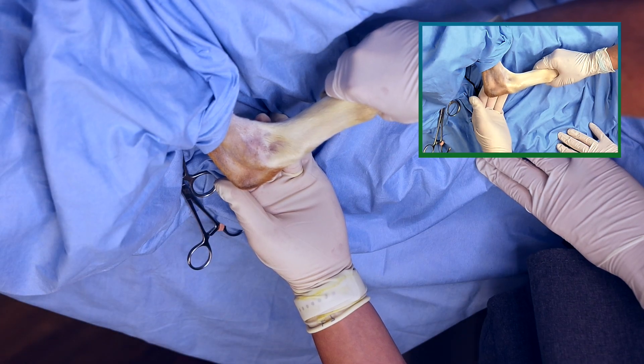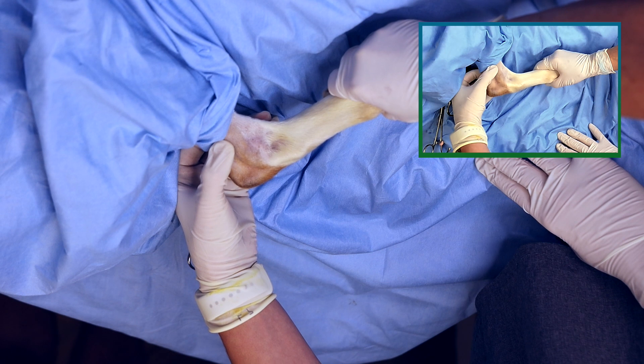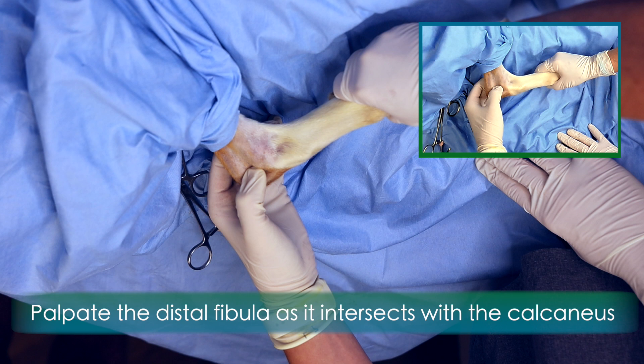To perform an injection of the canine tarsus from the caudolateral approach, the patient will lay in lateral recumbency. Begin with the tarsus in flexion. Palpate the distal fibula as it intersects with the calcaneus.